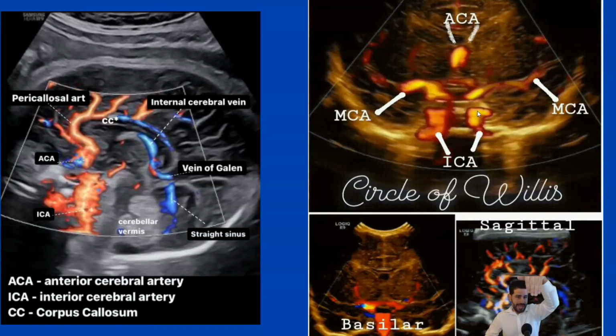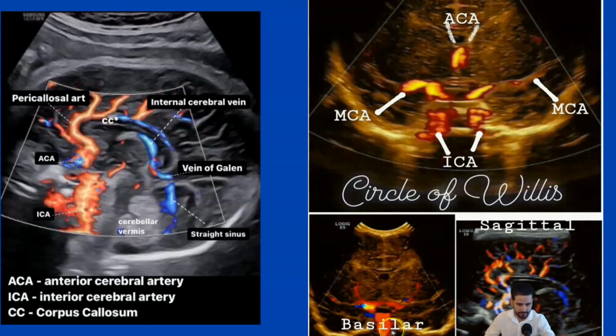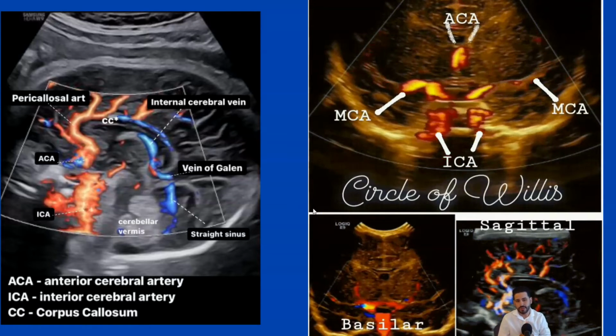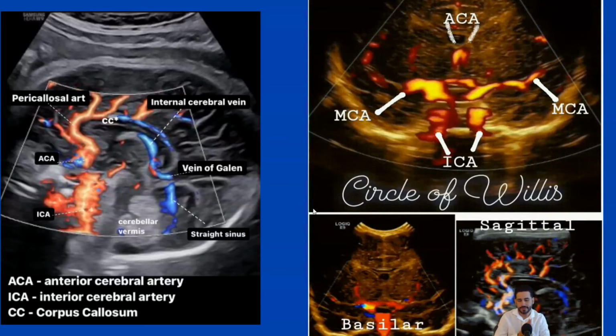In that view, if you angle posteriorly, you'll be able to see the basilar artery going into the circle of Willis. So that pretty much concludes the anatomical and technical aspect of this talk.